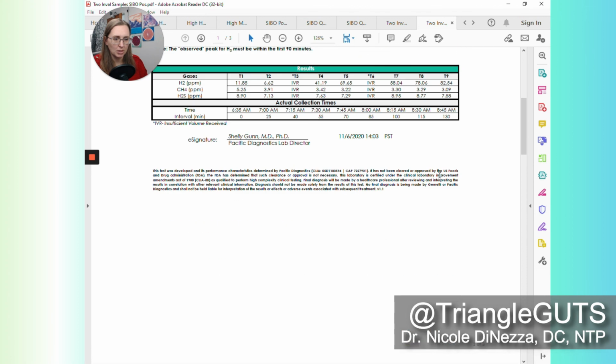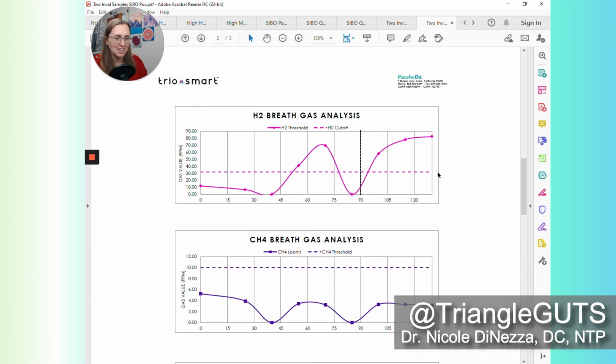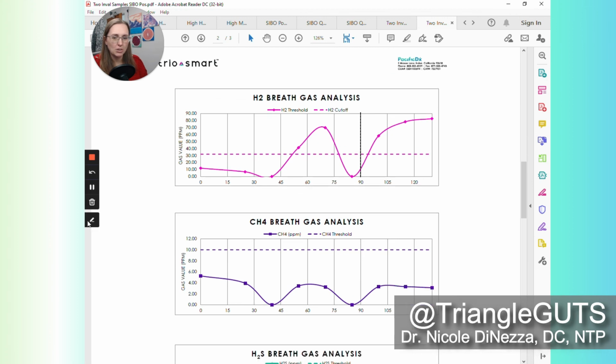So sample number 3, 40 minutes, is invalid. All right, and this gets very confusing. So again, what you need to do is almost draw a new curve, and assume that hydrogen is probably doing that. And similarly, at the 80-something minute mark, we're not really caring about it because this is lactulose. So even if we think, all right, we have 10 for a baseline and then we're going up, right about at the 60-minute mark it looks like we are going to cross that threshold.